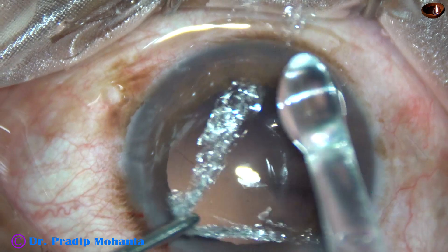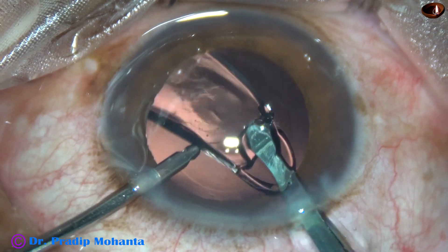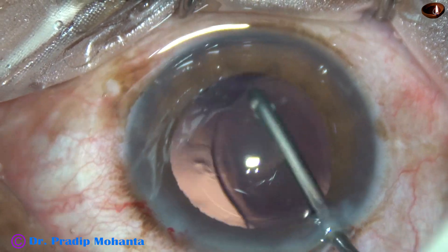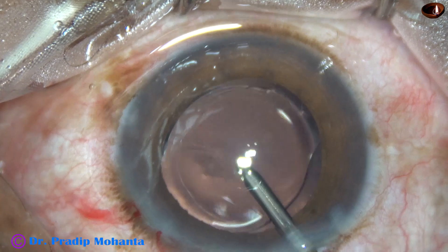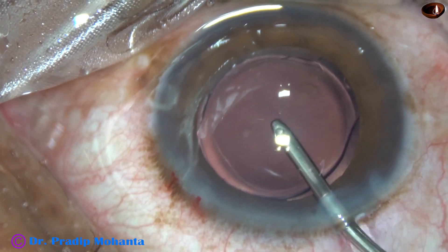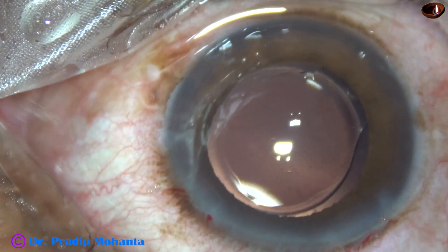This is hydro-implantation of a single-piece monofocal intraocular lens into the capsular bag. We can see that a thin rim of the anterior capsule is overlapping the optical part of the intraocular lens all around, confirming a 5.5 millimeter capsular rhexis.